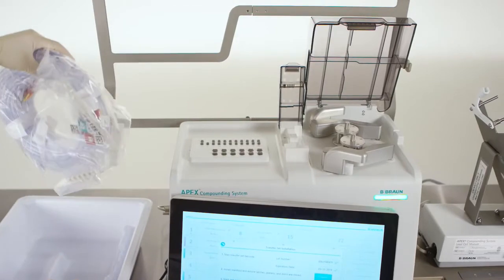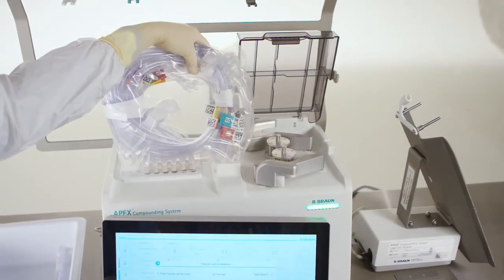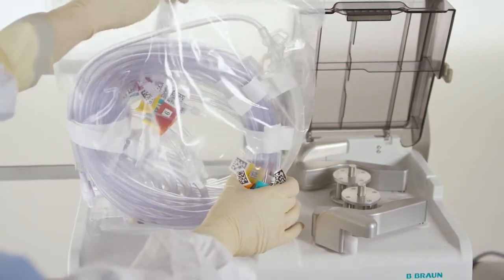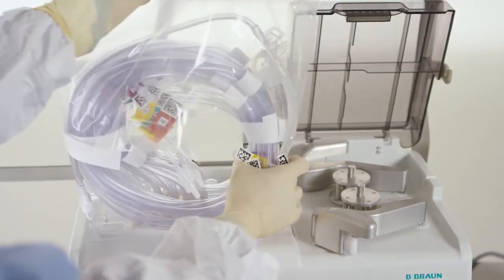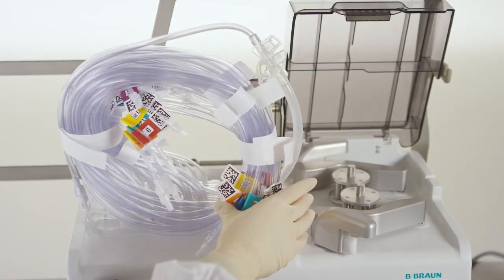Remove the transfer set by grasping it by the partial plastic sleeve designed to protect it from contamination. Ensure that the transfer set's tubes remain coiled, its caps remain in place, and no part of the transfer set touches anything outside of the laminar flow hood.